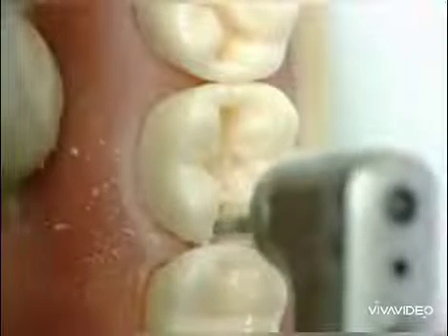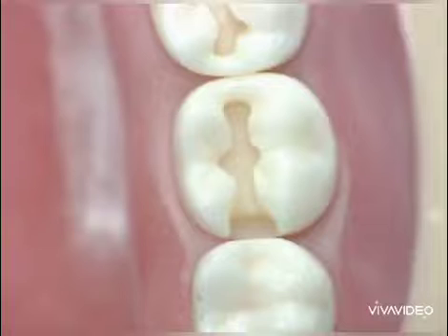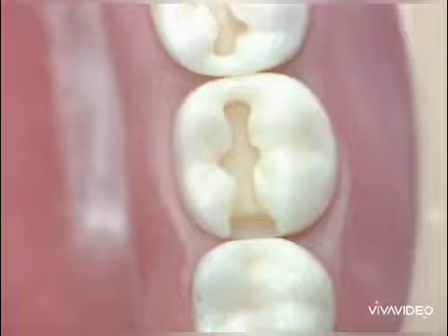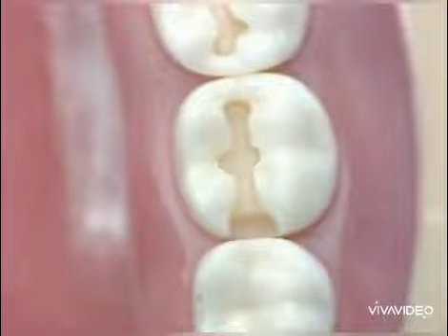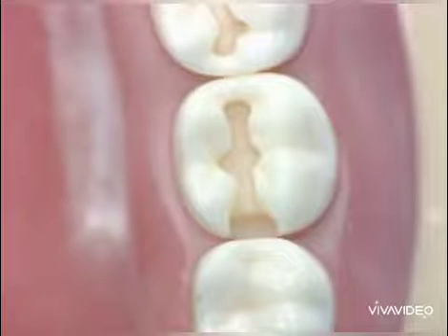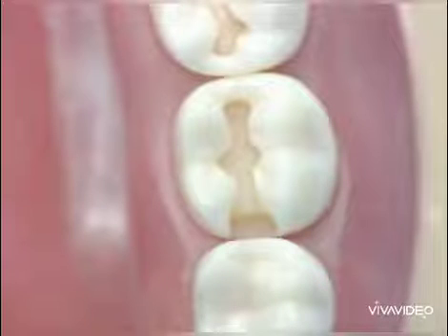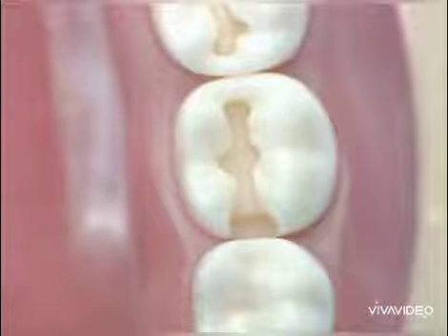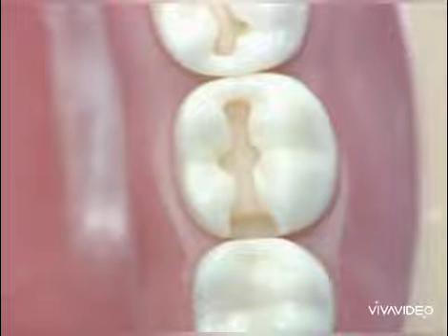Continue preparation of the proximal box. Smooth the gingival seat. This is the completed Class 2 cavity preparation. The buccal and lingual walls are converged occlusally, and the gingival seat is a flat, smooth, pulpal floor.